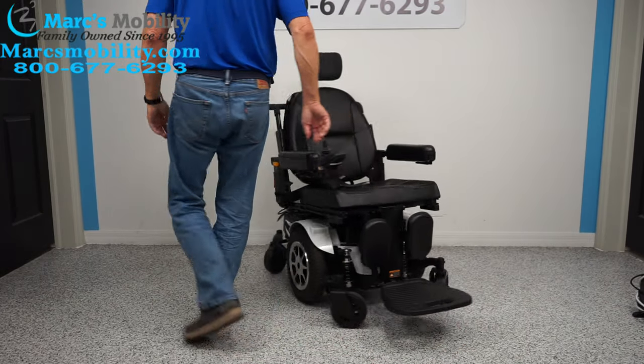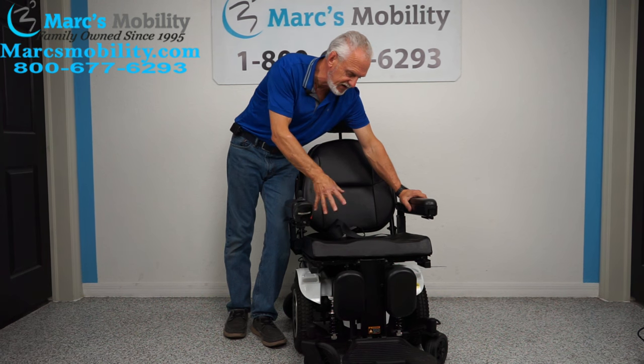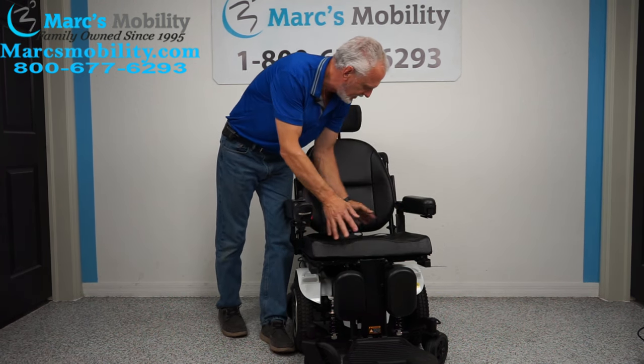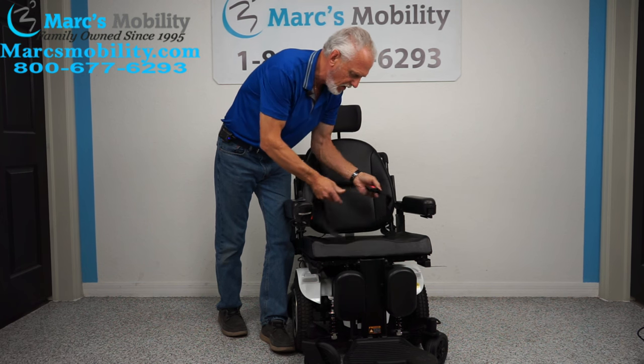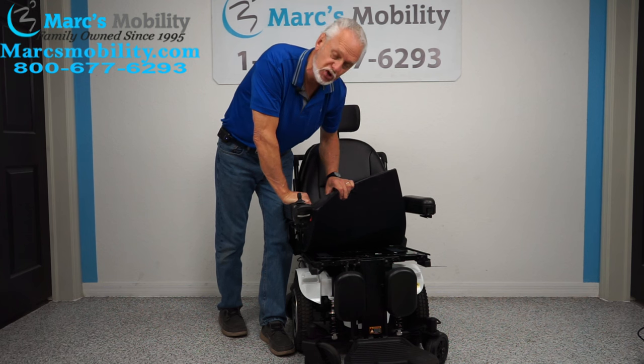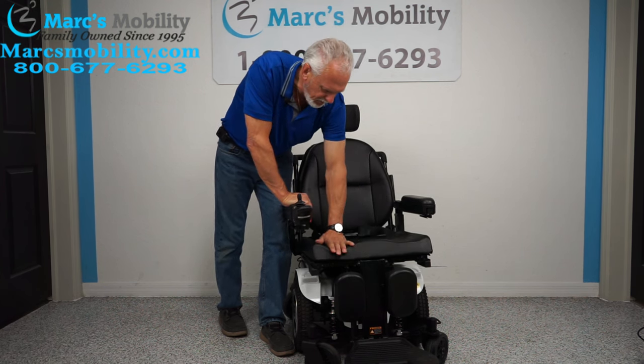The seat on this chair — we're not going to be able to change it. So if you're buying this chair, you're getting the seat that's on here now. It's 20 by 20 — 20 wide, 20 deep. You have a safety belt. You can put your own cushion on here if you want, though it already has a low-profile cushion.